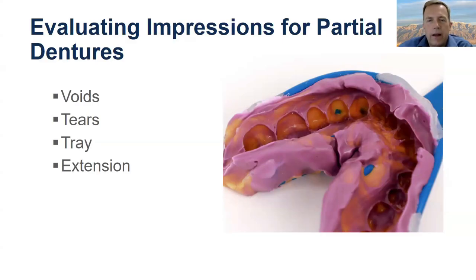All right. And you really got to look at all the places where the partial is going to contact: rests, guide planes, clasps, saddles. So basically, do this, don't do this.